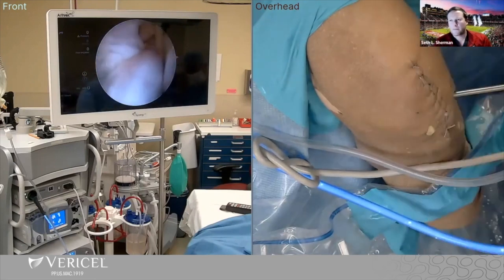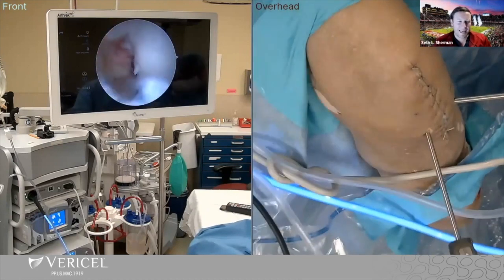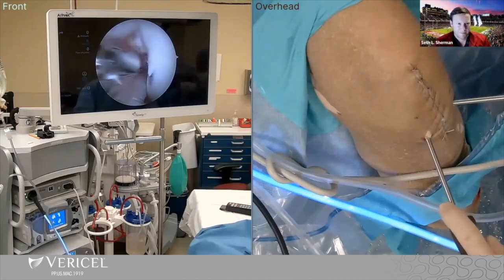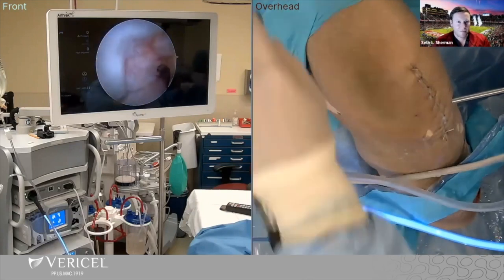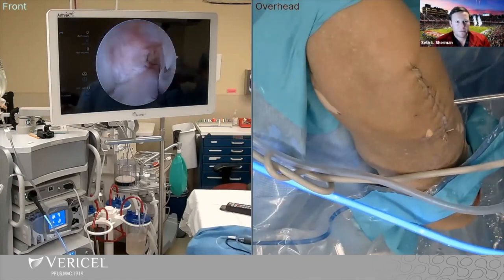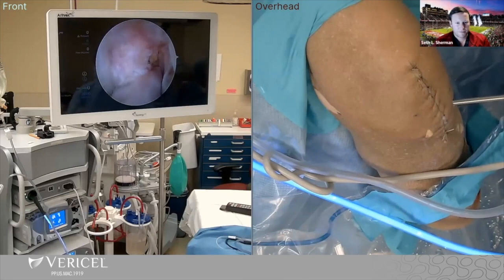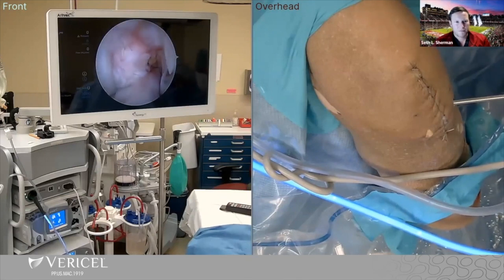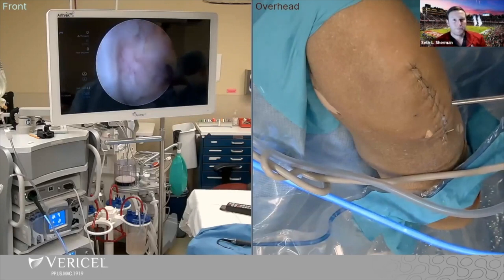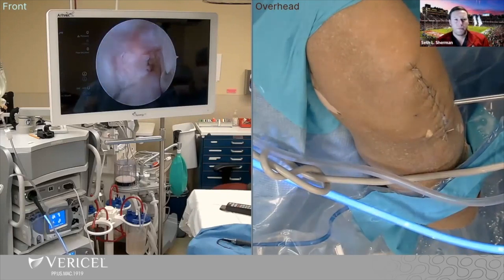What I found after doing a few of these is you want a shaver or something. Do you always take lateral or will you take from the top or the medial side? I actually will do both — a good one here and then switch portals and come from the other angle. I try to take about two to three tic-tac pieces, which is really nice. You don't do any damage, and I found I had enough for two or three MACIs. One patient I'm doing in two weeks — they canceled the case the week before and we were able to get another MACI for them. Every once in a while there's a problem — a snowstorm or power outage — and it really helps to have that backup.